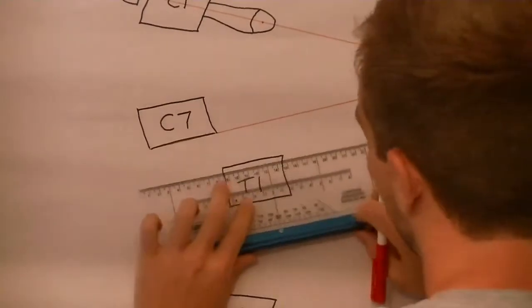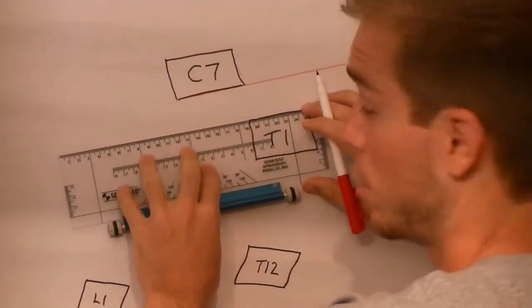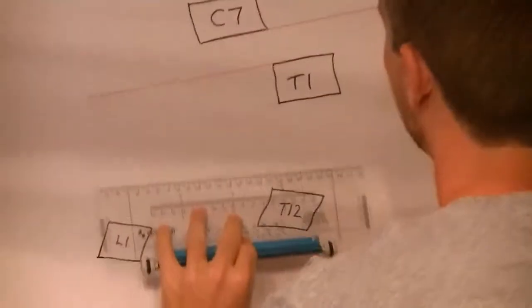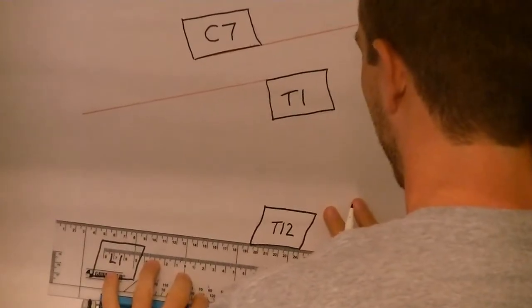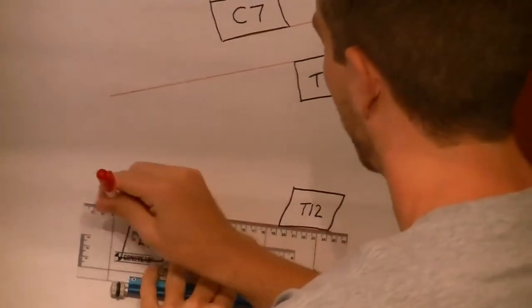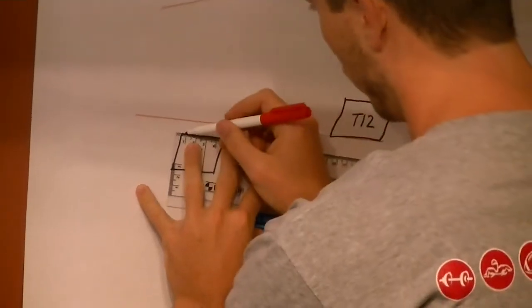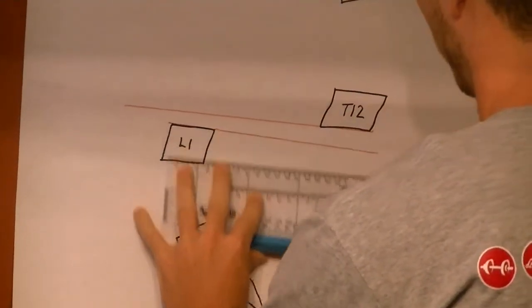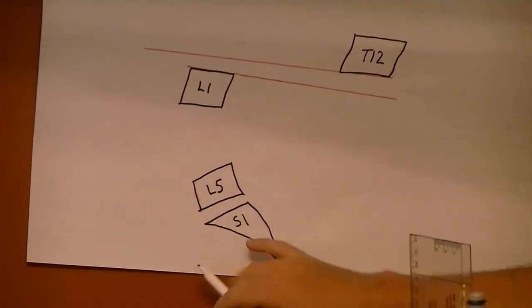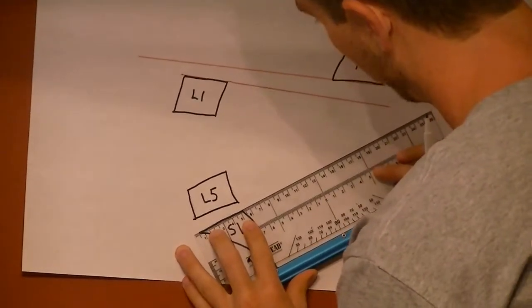T7, go the opposite direction, always towards the concavity. You always want to drive your lines towards the concavity. And on the inferior aspect of T12, superior aspect of L1. And instead of doing L5, we're actually going to do the superior aspect of the S1. So I'll just say around here.